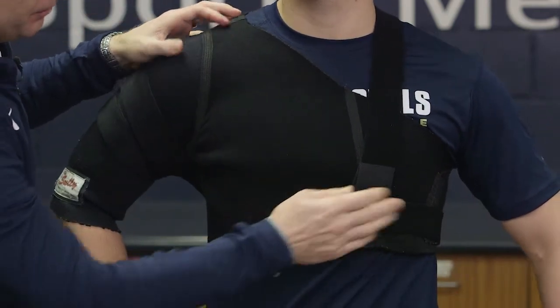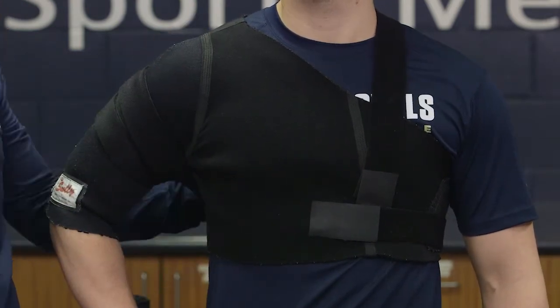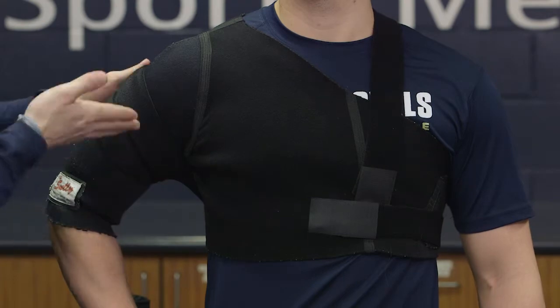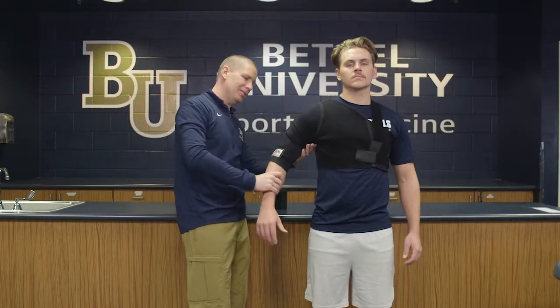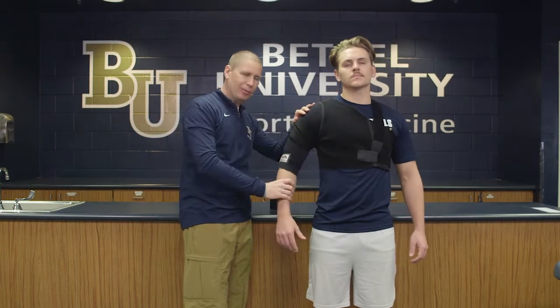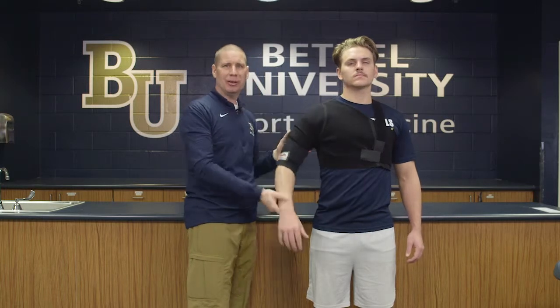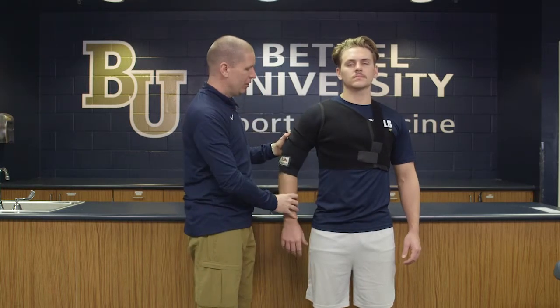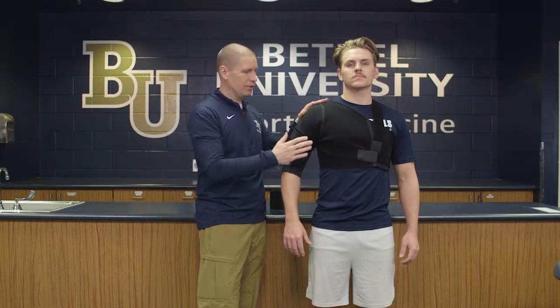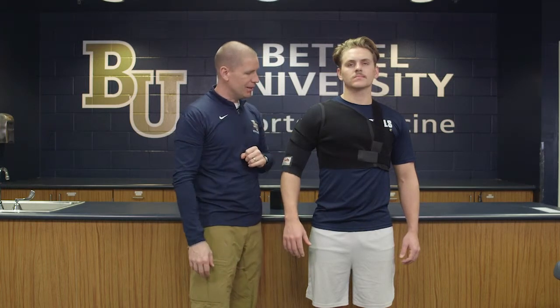It attaches here — all the brace support goes along the back, but because it wraps and curves around, you can see that it's going to pull, stretch, and keep his arm from coming down and also prevent his arm from going backwards. So it's providing all that stability and secureness while still allowing him to function, while also maintaining the mobility he needs.